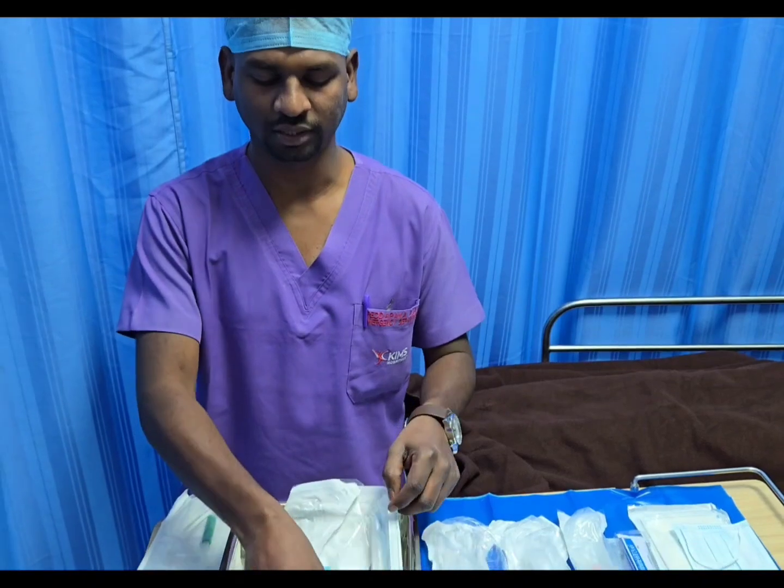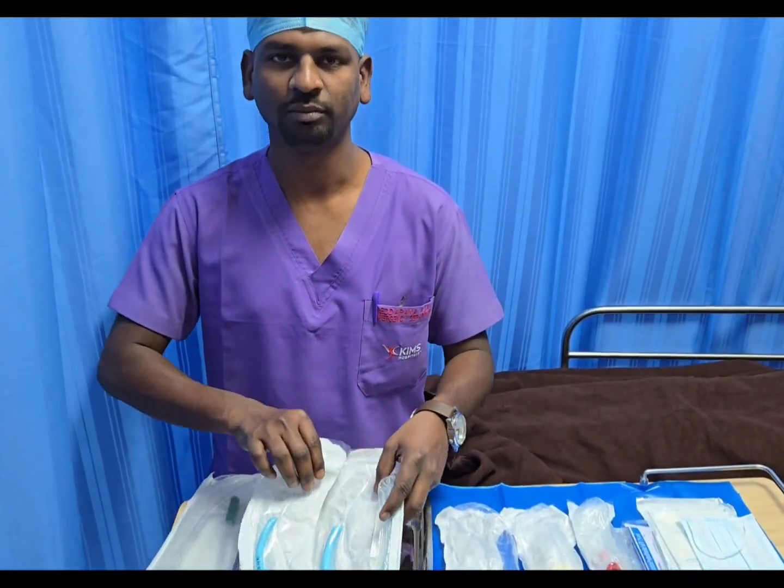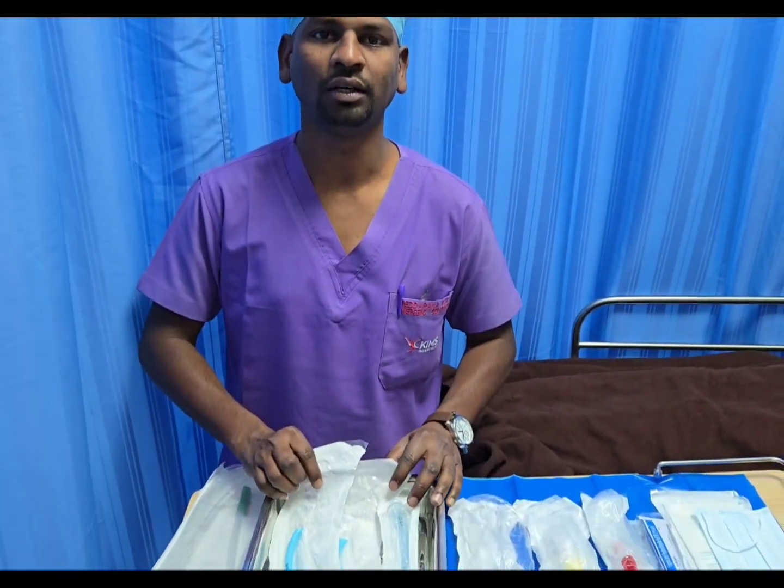Today we are discussing the oropharyngeal airway and the nasopharyngeal airway. Which equipment should we use? For the nasopharyngeal airway, we have to take separate sizes: number 8, 7 and 6. These are used in adult patients.